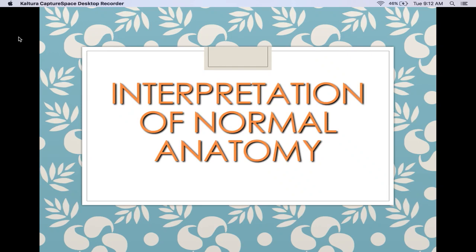Hello class, today's lecture is going to be on interpretation of normal anatomy. Now before you go any further, I want to be sure that you're all reviewing bony landmark terminology, so make sure you either take out your skull or review some orofacial structures notes to help you.